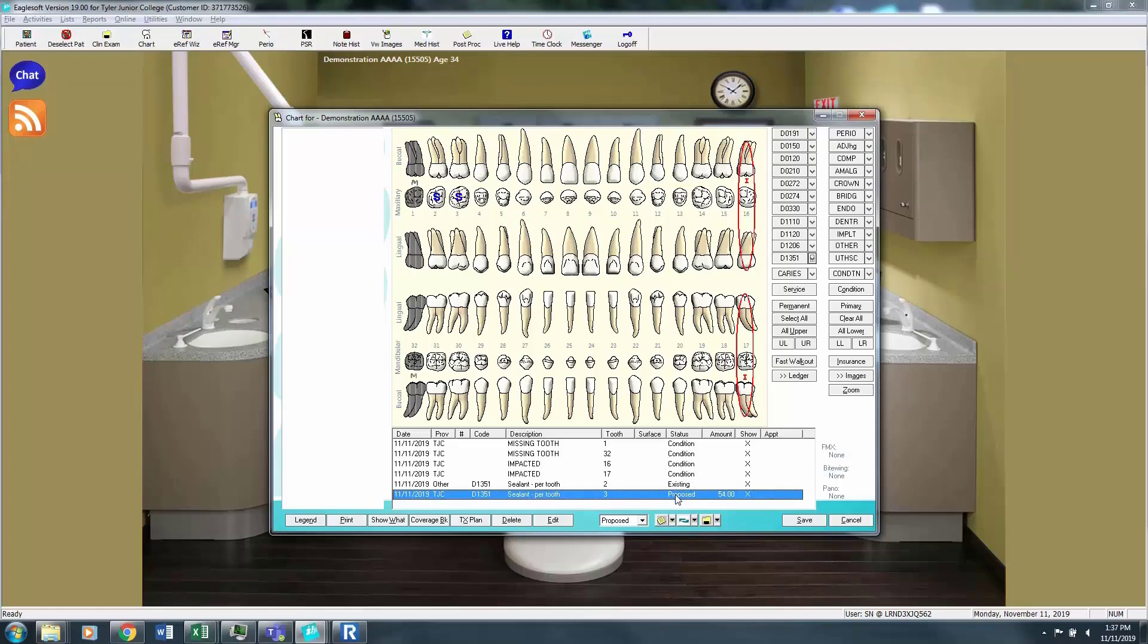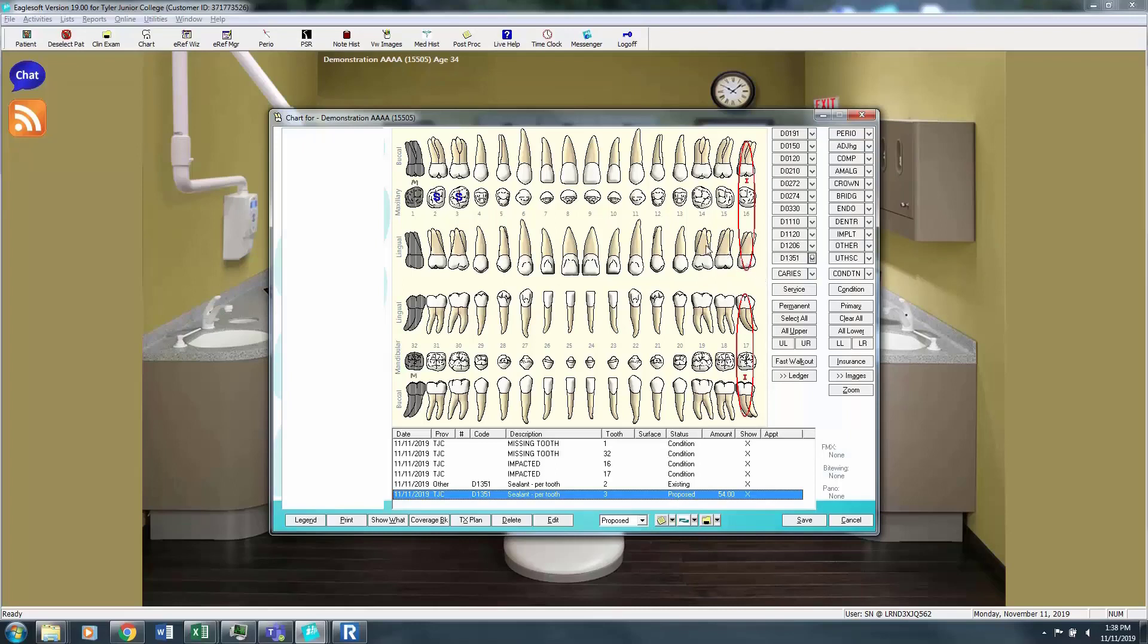This proposed sealant will show up when I do my treatment plan and will show the $54 amount. We will also put the sealants along with the other hygiene care that's proposed in the treatment plan and provide the informed consent for the patient based on that treatment.